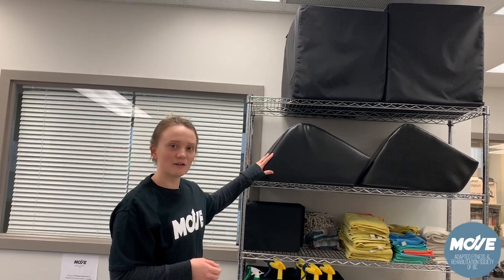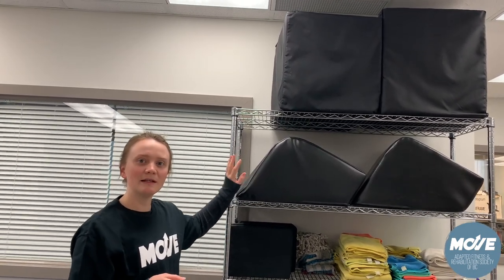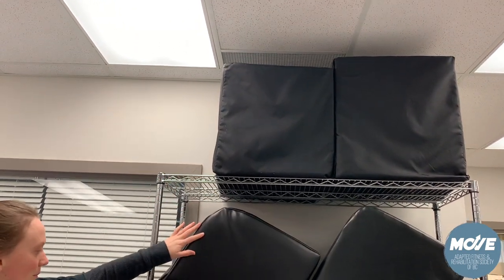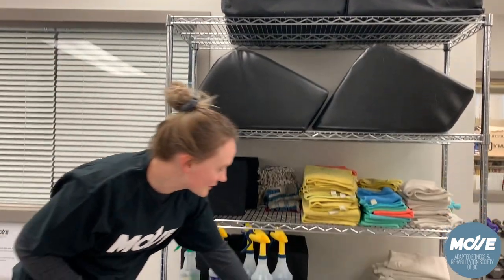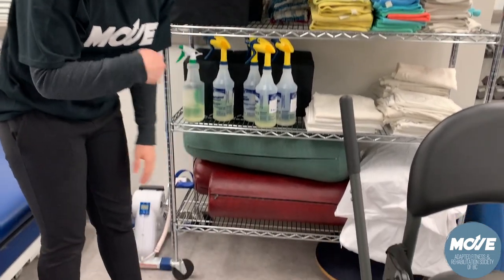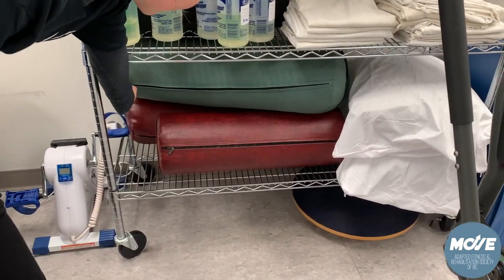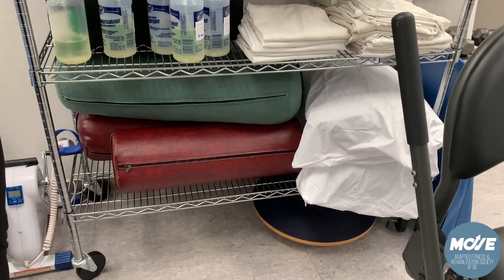For exercises on the plinth you may need a little bit of extra equipment for either back support, leg support, or just supporting your neck. So we have various blocks, bolsters, we also have pillows down at the bottom with removable pillowcases, and a little bit of extra support here for either under the knee or under the feet.